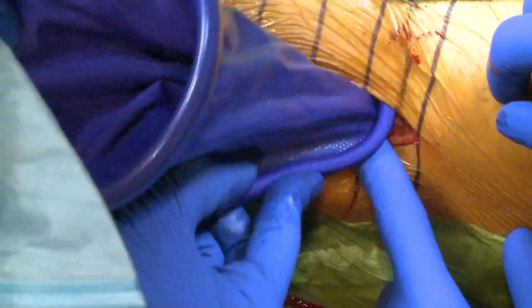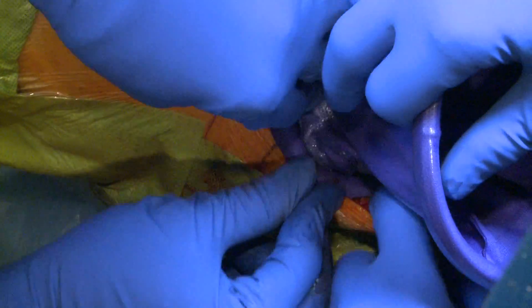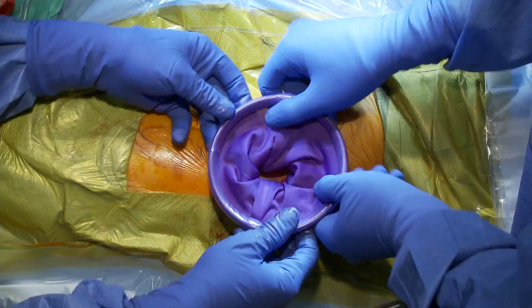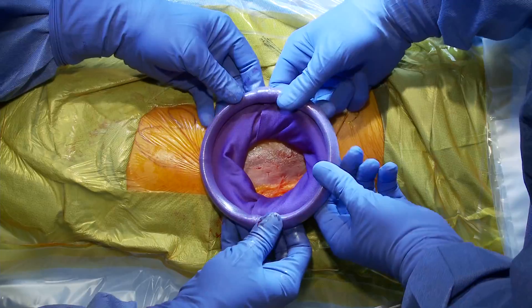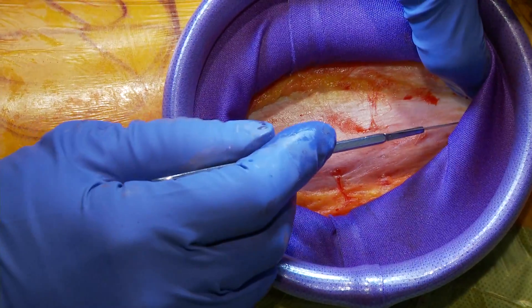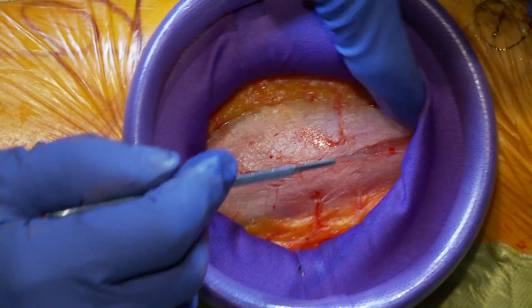We have a neat retractor here. I've just created a little superfascial plane and we put this inner ring in — this helps protect the skin edges and gives us a little bit of retraction. We can roll this down and now we're nicely exposed over the TFL.